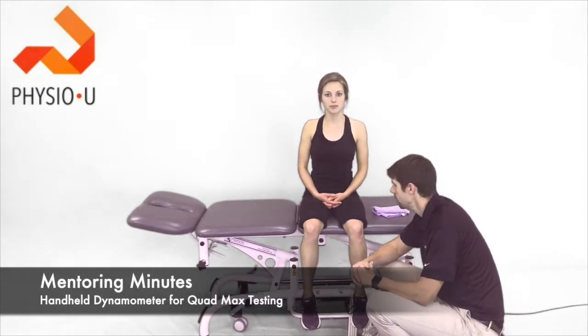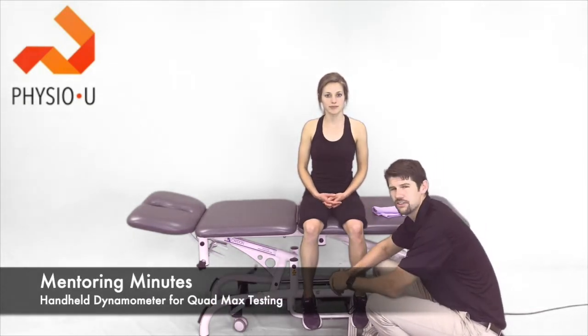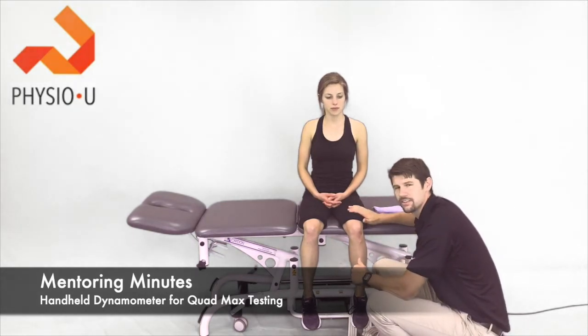Hey guys, Marshall here with PhysioU and I'm here with Kristin. Today for the Mentoring Minute we're going to be talking about quad max muscle testing.